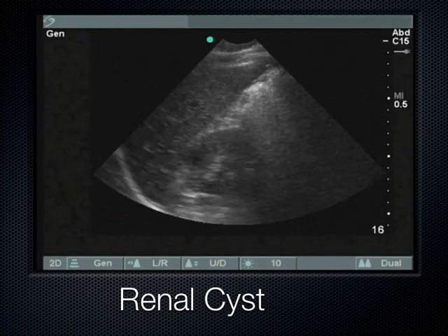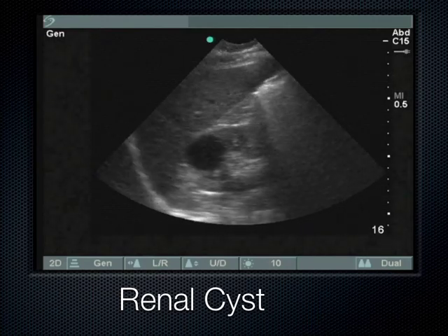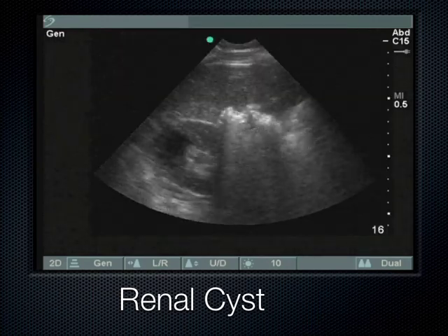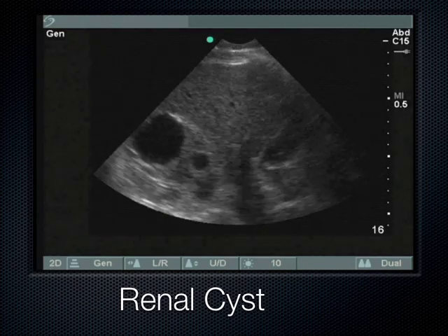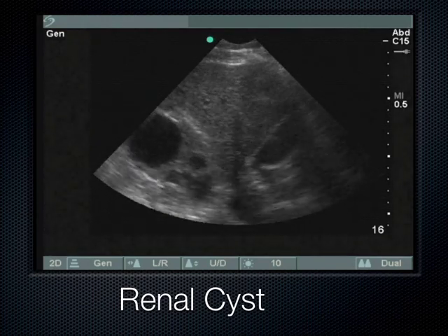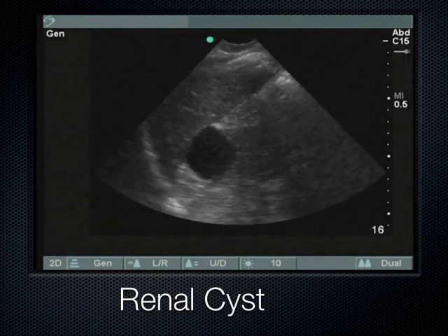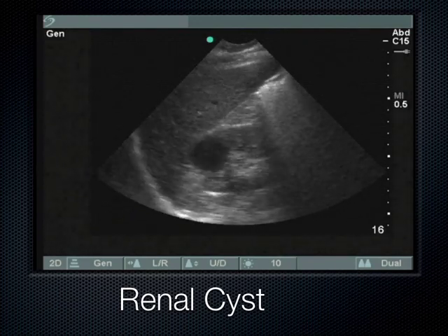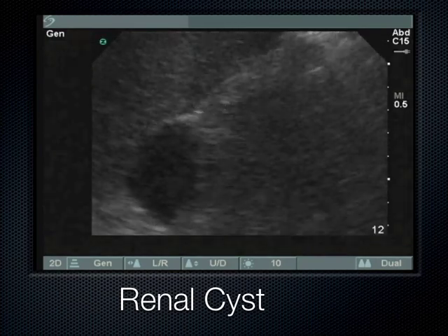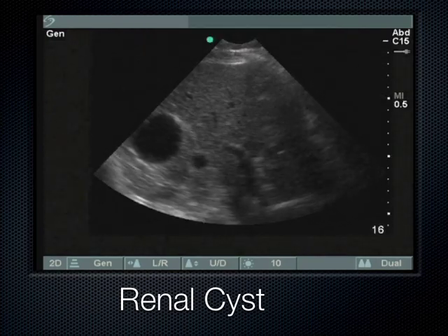This is an example of a renal cyst — notice it's out in the cortex of the kidney. We can see one cyst up near the upper pole and another small cyst nearby. No matter how you rotate the probe from transverse to coronal, the cyst is always spherical and anechoic in all planes.